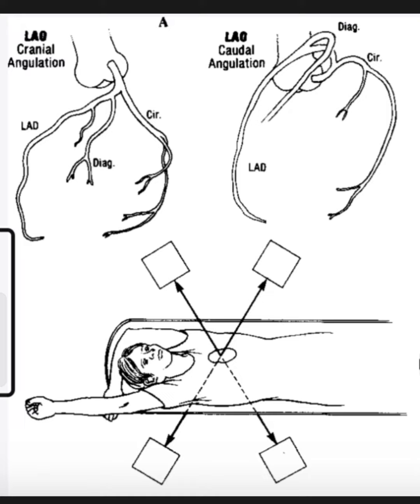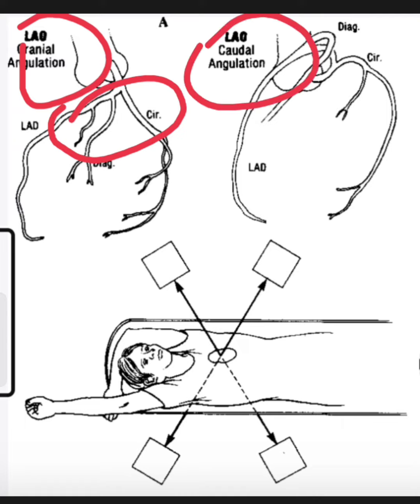Now in the LAO cranial angulation, you can see the base of the circumflex and LAD. While in the LAO caudal angulation, you can see the distal branches of the circumflex and LAD.